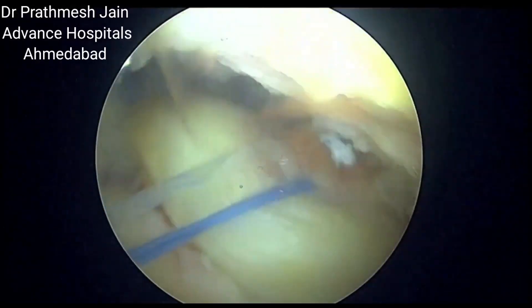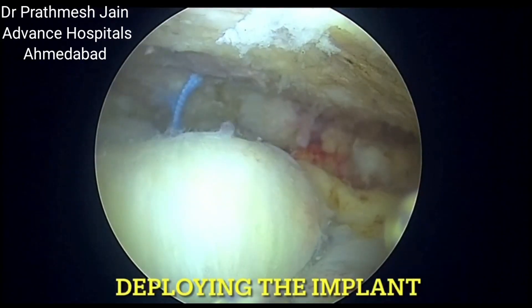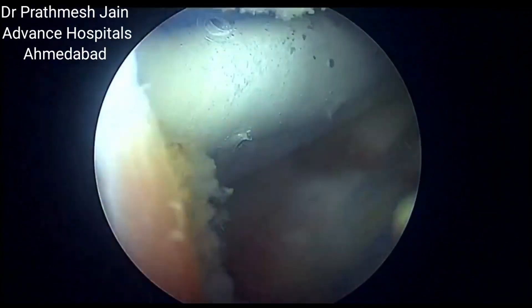Regenten is a bio-inductive implant which increases healing in a rotator cuff tear. It decreases the re-tear rates.